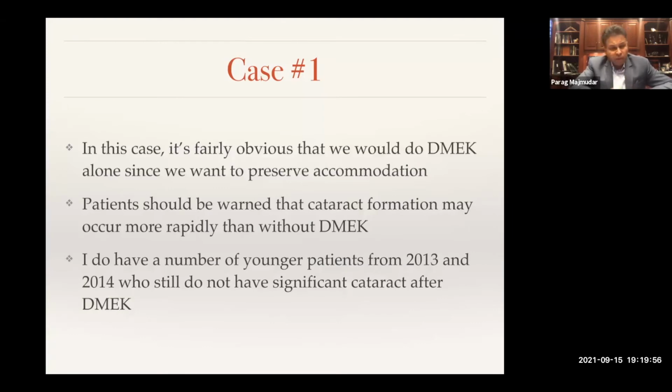I think our management of the air bubble or the gas bubble has evolved. And I think that you can probably get by, and it's not such an automatic thing that they're going to get cataract. I do have some patients from 7, 8, 9 years ago who were in their 40s, maybe early 50s, and I did not do cataract. At that point, I was telling them every year, hey, you're going to get cataract, you're going to get cataract. And they're still like, hey, doc, I'm seeing great. I don't have any issues.